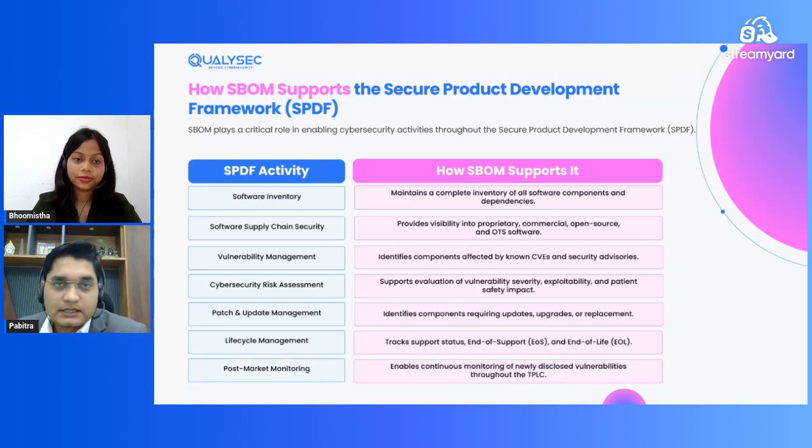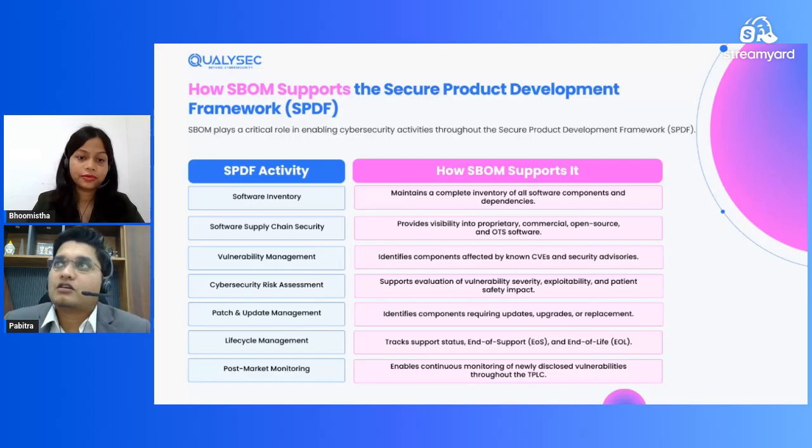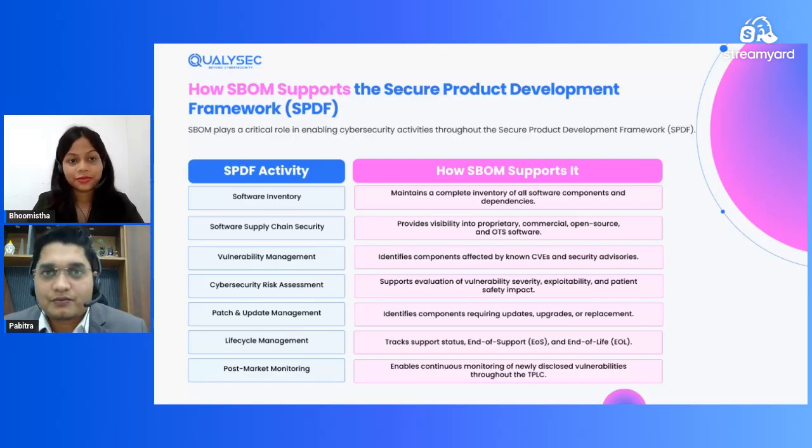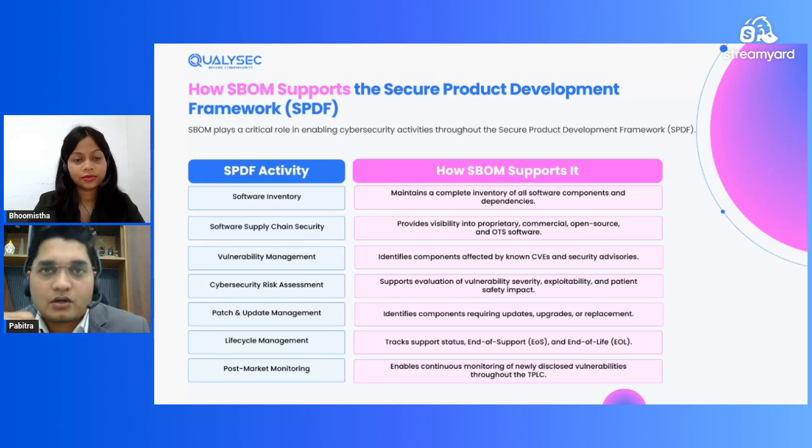And last, and a very important thing, is post-market monitoring. Just think of what the FDA wants, not just a successful submission. The FDA wants you not just to market a secure product, but to keep it secure throughout its product life cycle journey. And SBOM is the first and a very essential component of it.